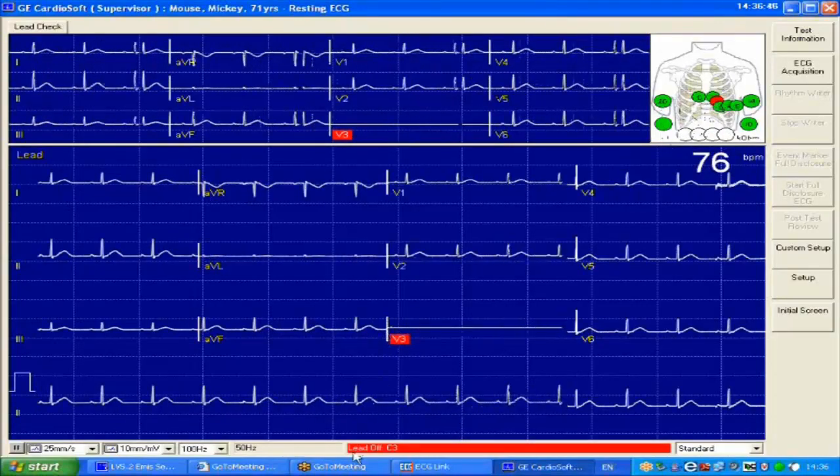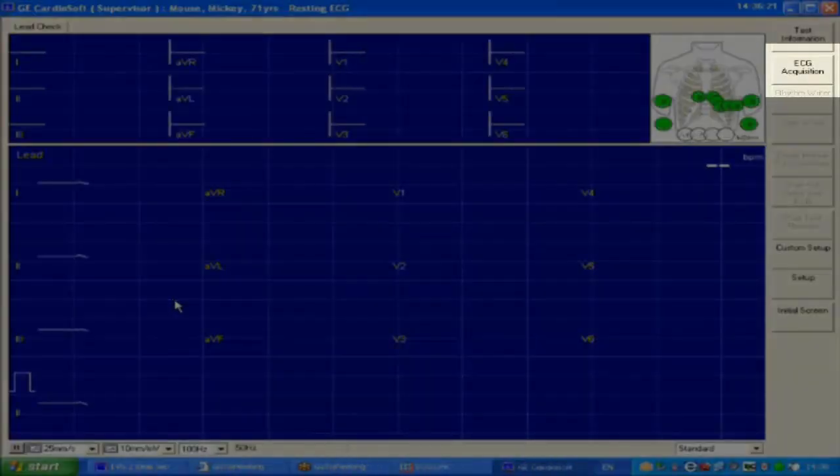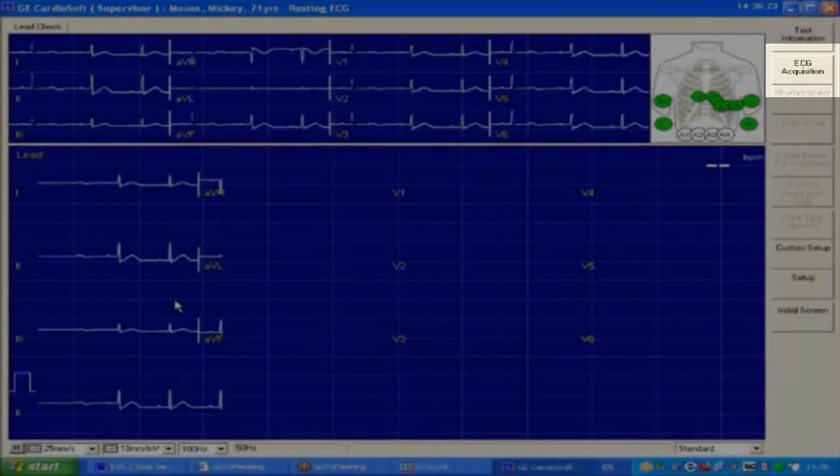Once done, the red indication will turn green, showing the connection is good. We can then press the Acquire button, which then takes the ECG.